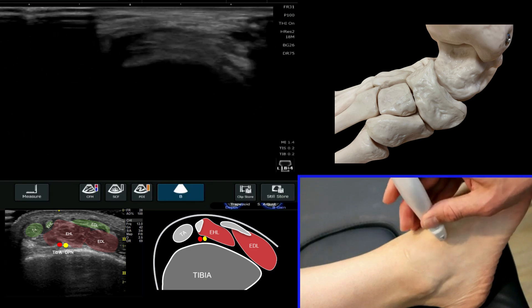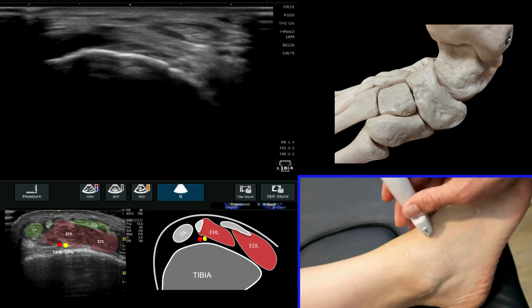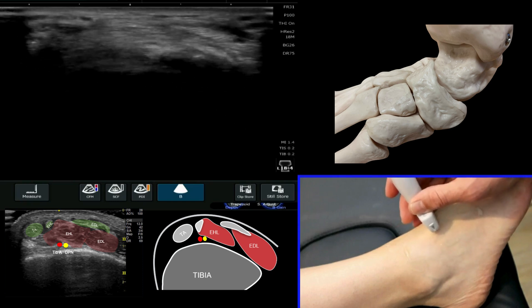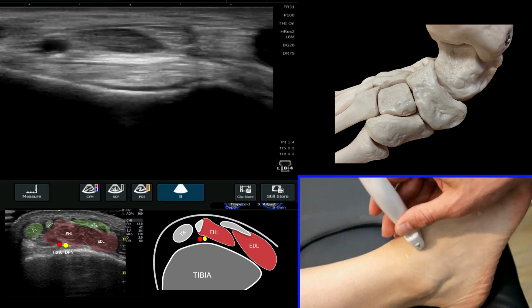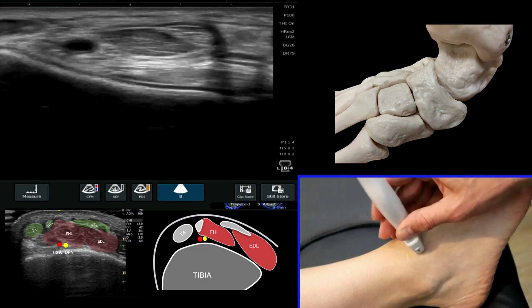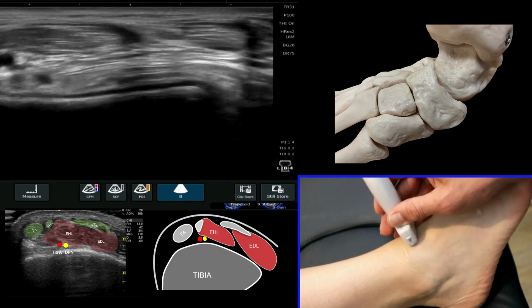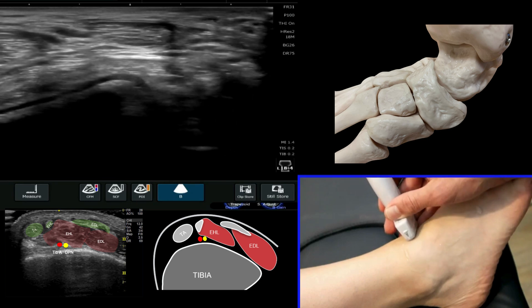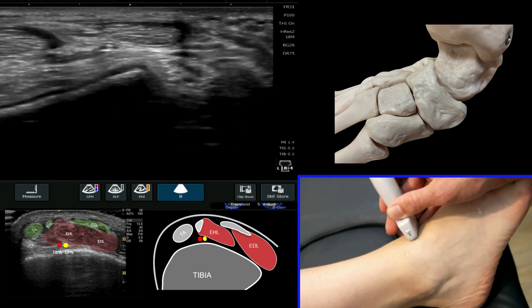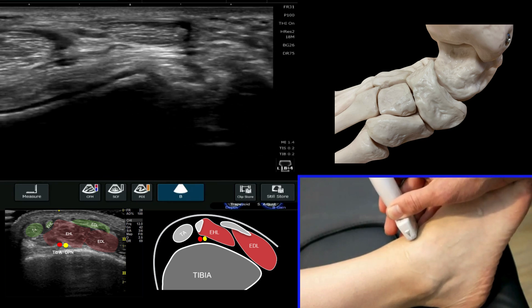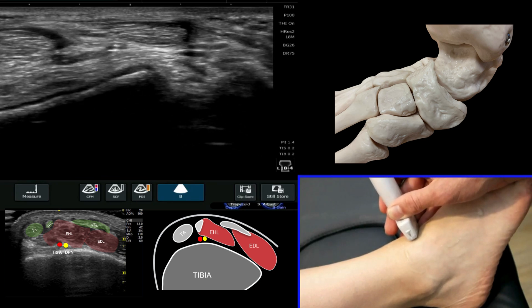If we come back up, we can come back across and find the neurovascular bundle, the EHL core, and the tibialis anterior tendon to finish with.